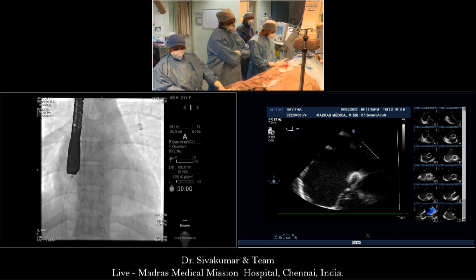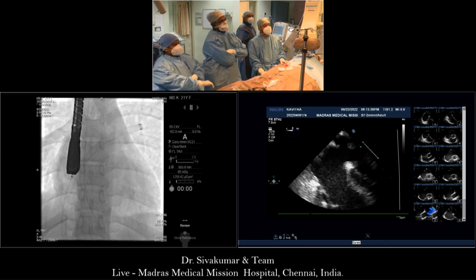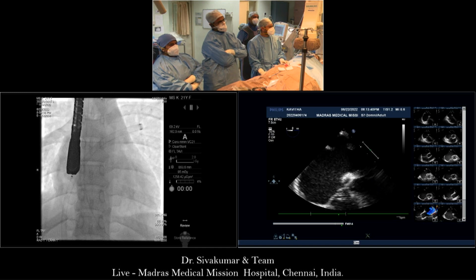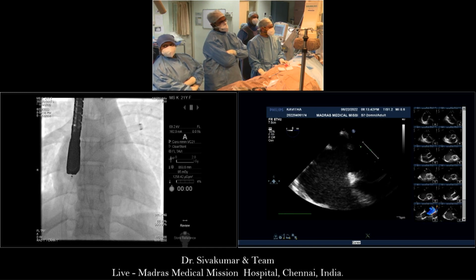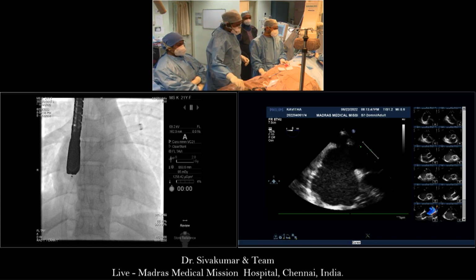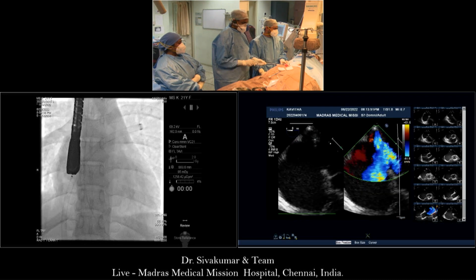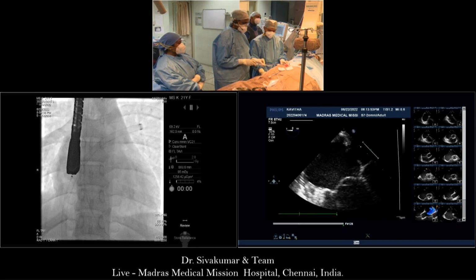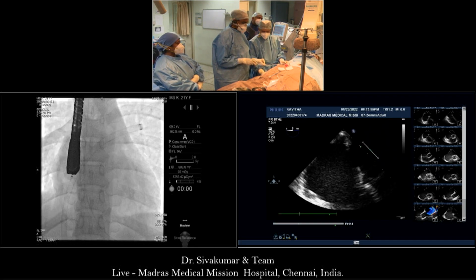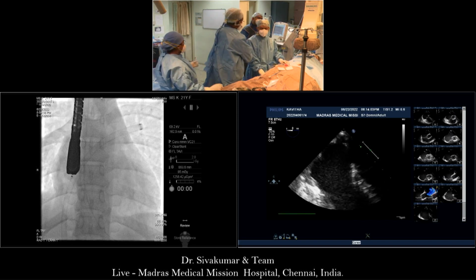So, a couple of things are very important. When you look at the aortic rim, if the aortic rim is absent, we must all remember that bald aorta has to be seen in multiple views. That's the key. If you see aortic rim and you go from 20, 30, 40, 50, 60, 70 degrees, you're seeing the aorta in all these views. If you see aortic rim in any of these views, then it's not bald aorta. Bald aorta has to be seen in three consecutive views. If you go to 30, 40, 50 and you have bald aorta, then you have a high risk. This patient is fully heparinized?